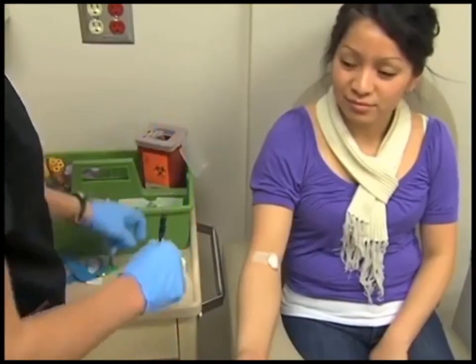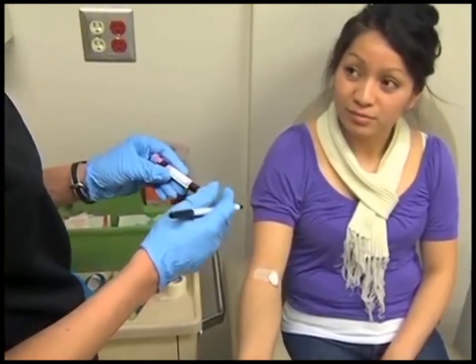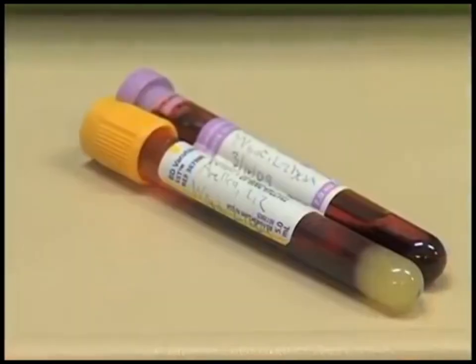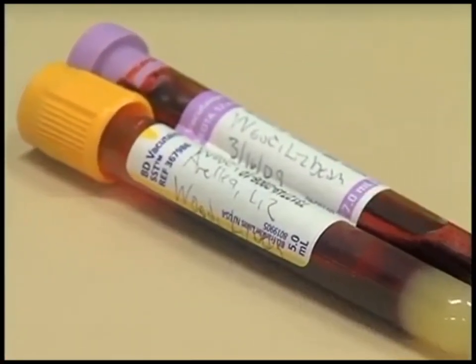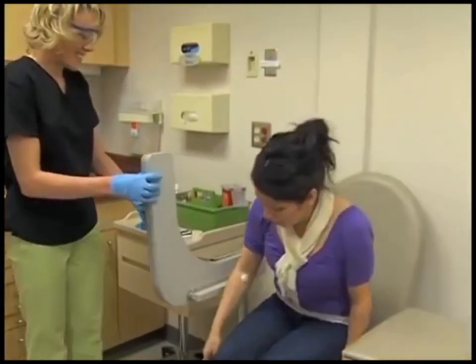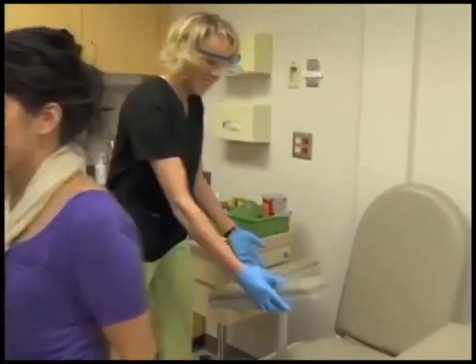Label the tubes with the patient's first and last name, date of birth, time the blood was drawn, and your initials. Make sure the patient is feeling fine and not dizzy or lightheaded before they stand.